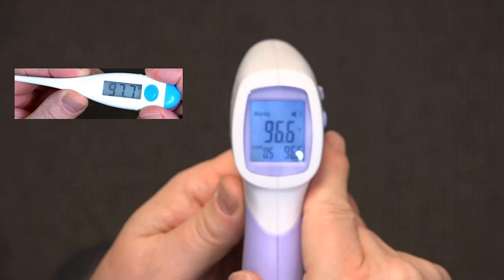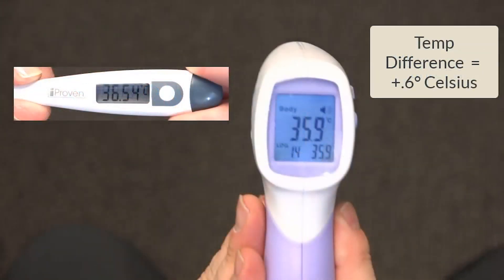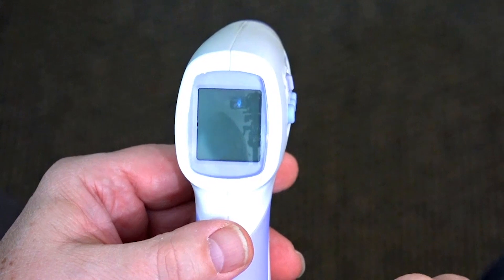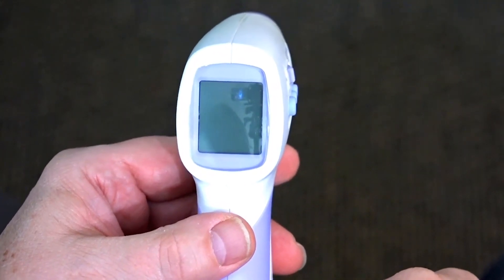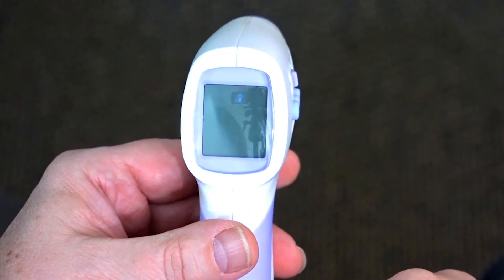Calculate the temperature difference between the two thermometers. The temperature difference between the two thermometers is 1.1 degrees Fahrenheit or 0.6 degrees Celsius. In this example, the uncalibrated non-contact infrared thermometer was 1.1 degrees Fahrenheit lower than the clinical reference thermometer.